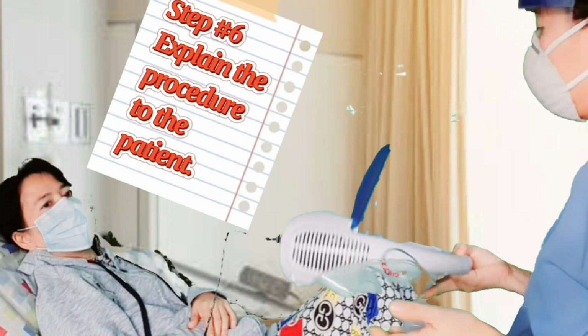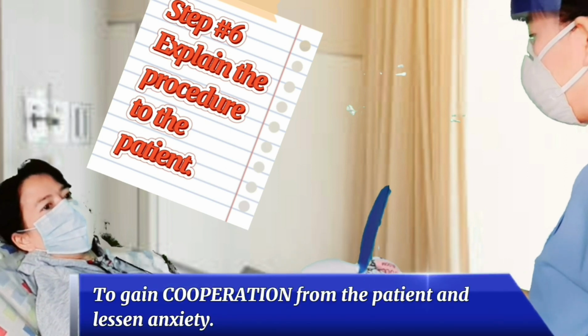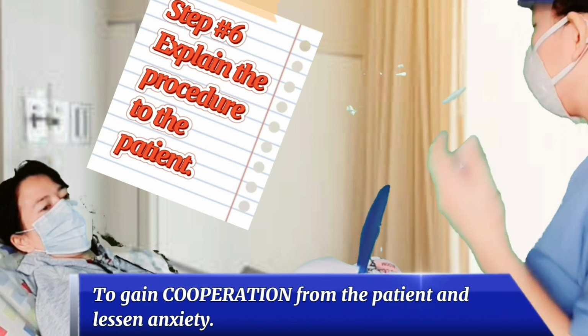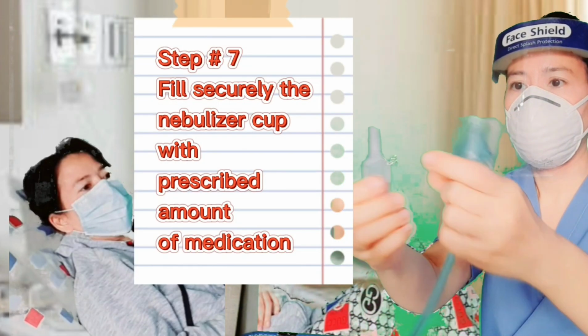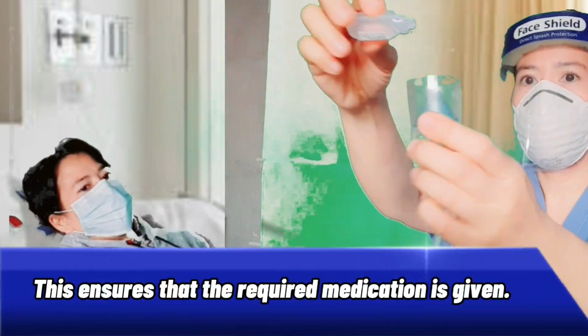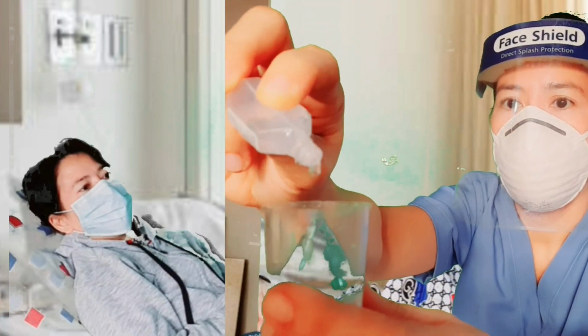Step number 6. Explain the procedure to the patient. As a nurse, you will gain cooperation from the patient's part and somehow lessen anxiety, thereby promoting effectivity of therapy. Step number 7. Fill securely the nebulizer cup with prescribed amount of medication. This ensures that the required amount of medication is exactly given.